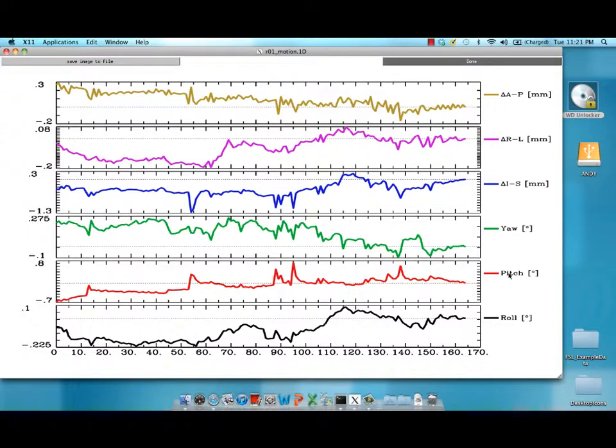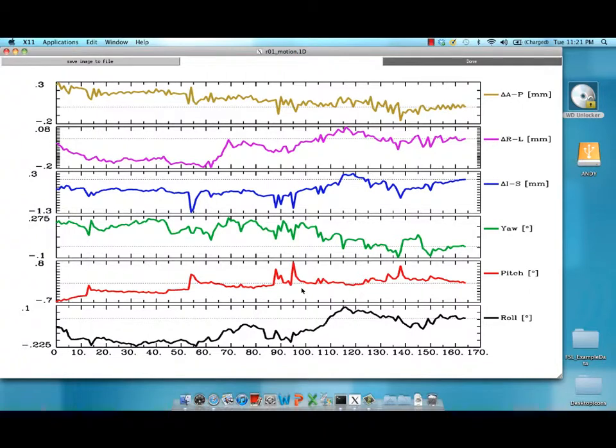This is pitch. This is when the subject nods their head forwards and backwards. That's the most common type of motion that you'll see in your data. Because it's easiest for the subject to do.